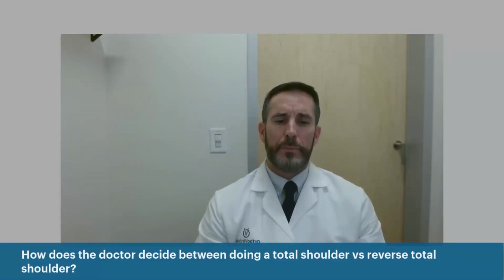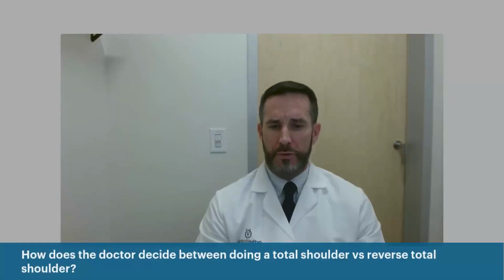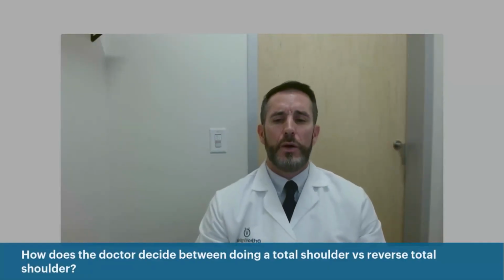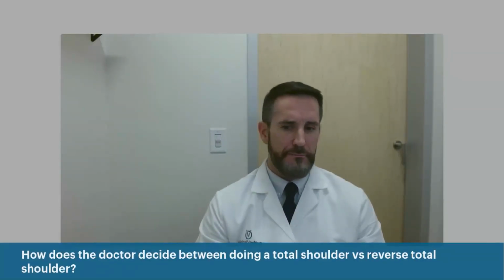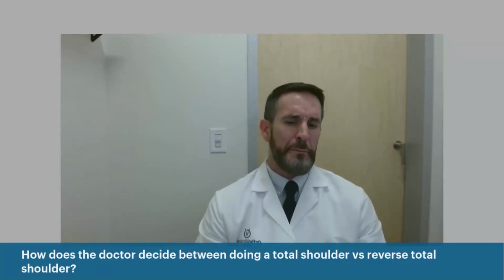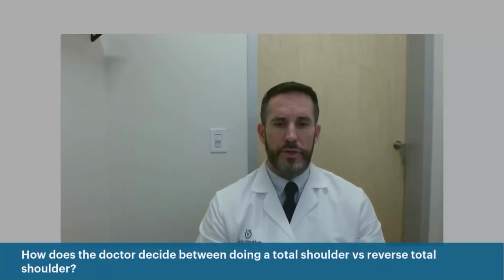An anatomic replacement typically will give you a little better range of motion in a similar setting compared to a reverse. So it does get a little tougher to make that final decision, but I do have a conversation with patients in the office about that. But the main determinant is status of the rotator cuff tendon.